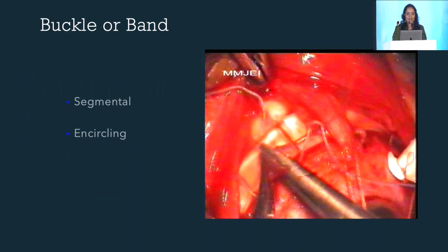A buckle or band is up to the surgeon's discretion depending on the support that the base needs, especially if it is inferior retina and inferior vitreous base. Total encerclage with a 240 band or a segmental buckle, a large one like 279, can also be placed.